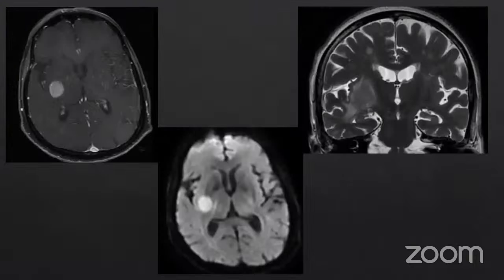We have a few more images. Now I think most of you will get the correct diagnosis. So this was the same patient who came after a few months. Now with this lesion, what do you think? Multiple cranial nerves and then a focal lesion.